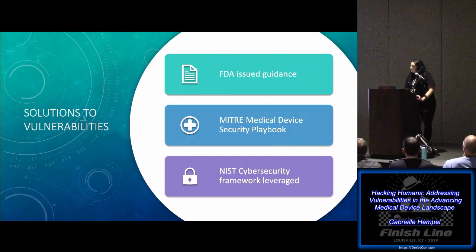The FDA is also leveraging the NIST cybersecurity framework. It's composed of 5 core functions: identify, protect, detect, respond, and recover. They also have been assembling information sharing analysis organizations and holding forums. And finally, they've been partnering with the Department of Homeland Security in order to mitigate wider attacks.